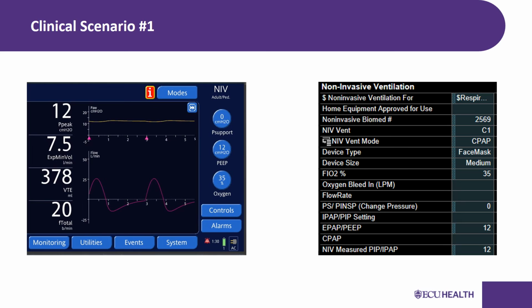In the future, the VCG is going to be looking at adding CPAP to the terminology of the EPAP/PEEP row. Right now they're currently separated, but this is going to take some time with upgrades in Epic.